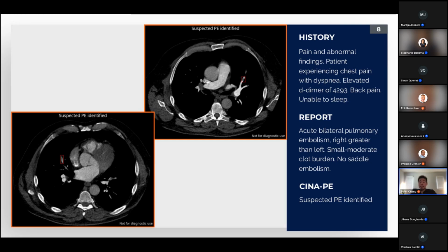Here's, again, a classic example of a patient who comes in to the emergency room with a concern for pulmonary embolus. Now, despite the strong clinical suspicion, as in many hospitals, this patient may nonetheless wait 2 to 3 hours before the original images are actually interpreted, just due to the extraordinarily high volume of patients in the ER and the inability to actually know which patients need engagement and interpretation first.